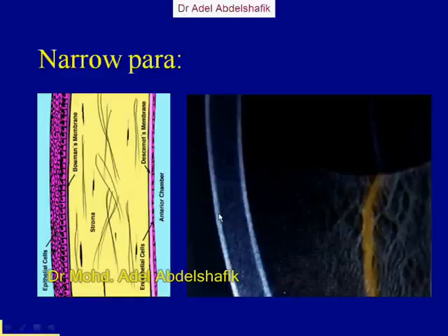So if you try it clinically, you make a very narrow section. You first make a good focus of the eyepieces. You use one eye, focus that eyepiece, then cover the other eye and focus the second eyepiece, then open both eyes. Now you get a very clear image, and you concentrate on this part of the slit lamp. You will see it as a double line. Bright line, black zone, bright line.